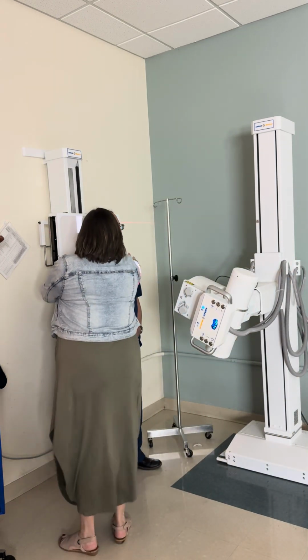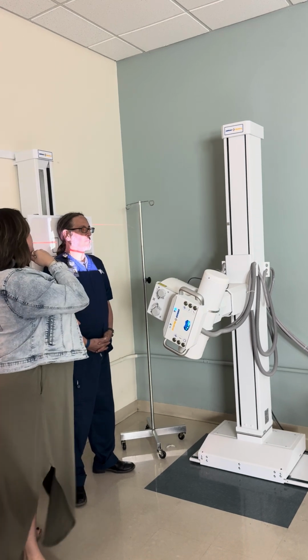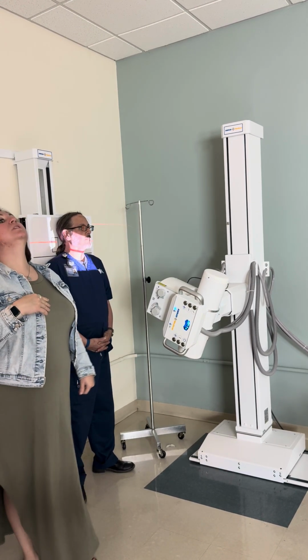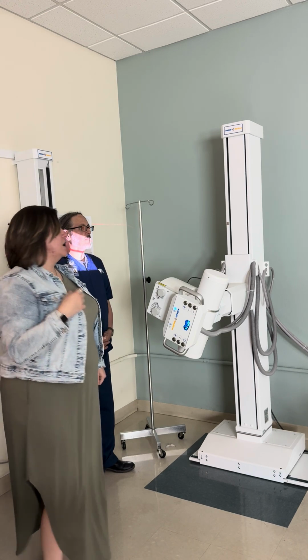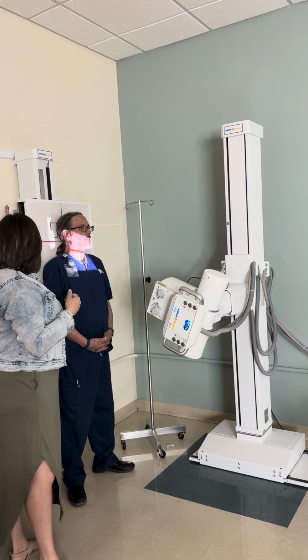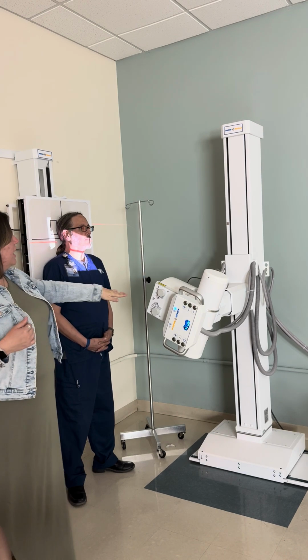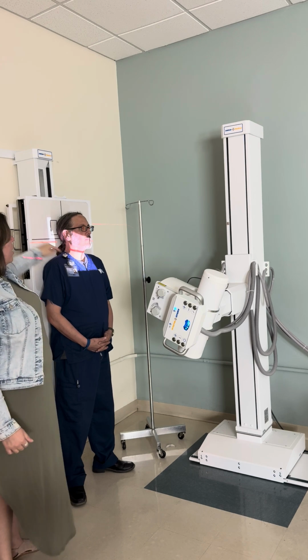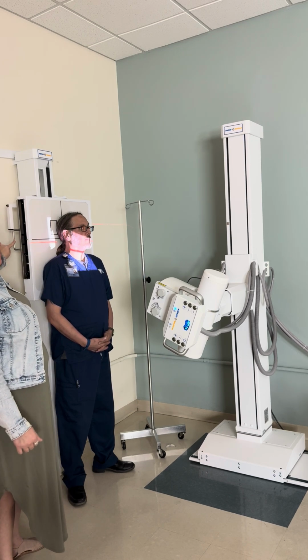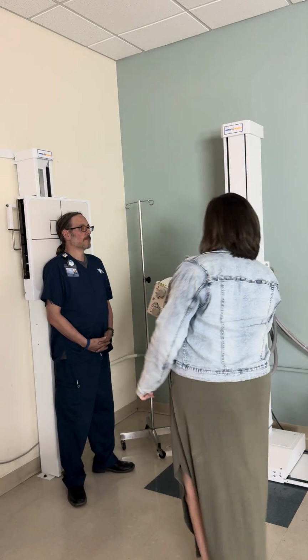Okay, so I'm gonna have you come this direction just a little bit, right about there. And we want the chin up, perfect. We want good posture, chin up. We don't want the chin way up, but we don't want it down as well, okay? So I'm gonna line up my Bucky, coming up behind you. And because of the angulation, we're not worried about our image receptor being lined up here on the wall Bucky. We want it in line with the handle, right? So I'm good there. I'm at about the level of C4.